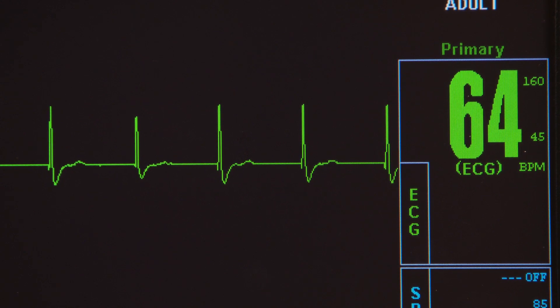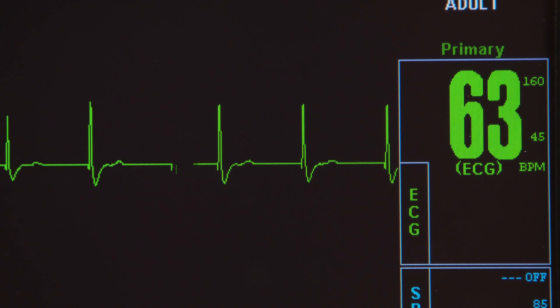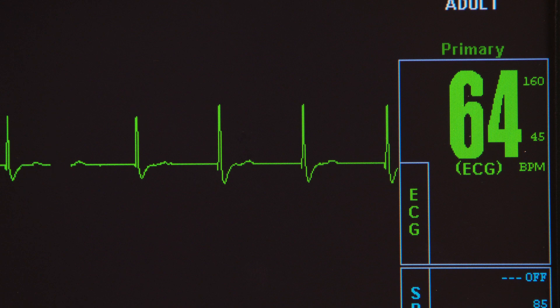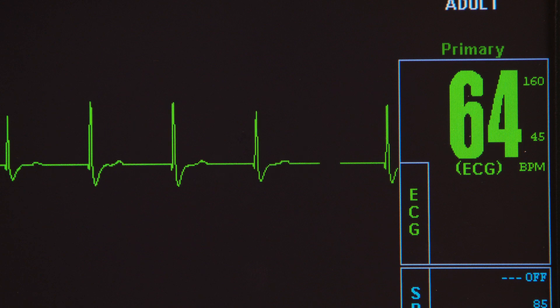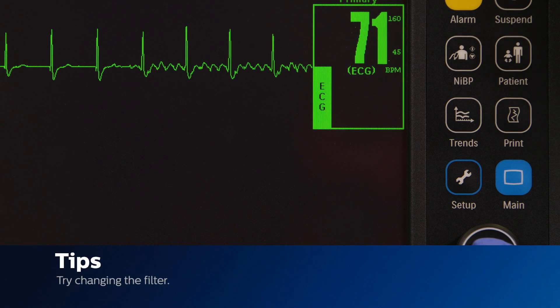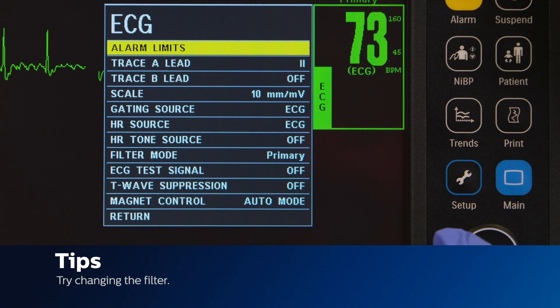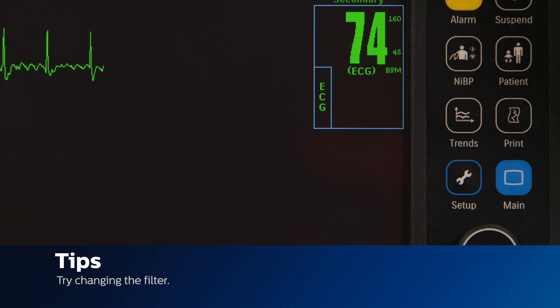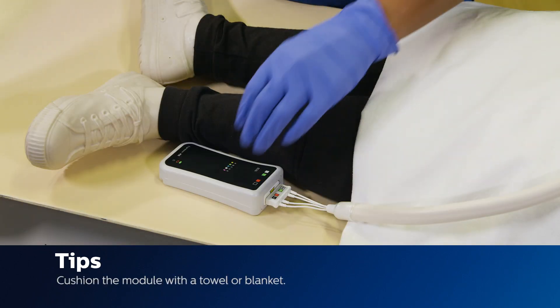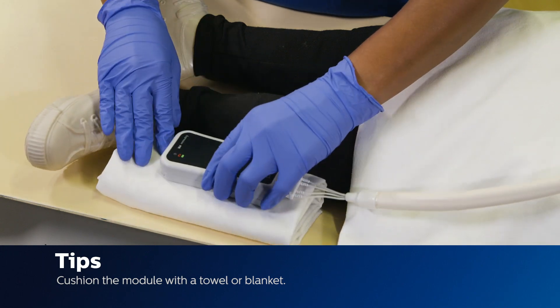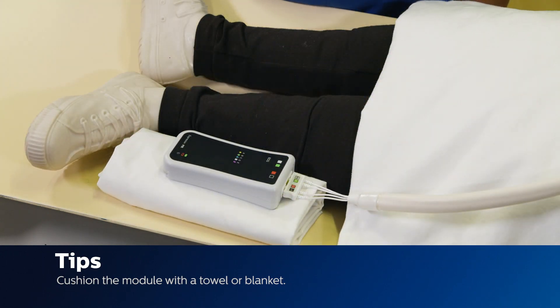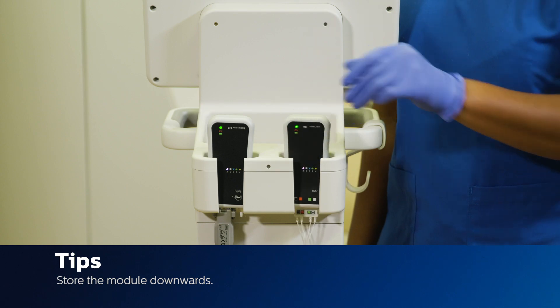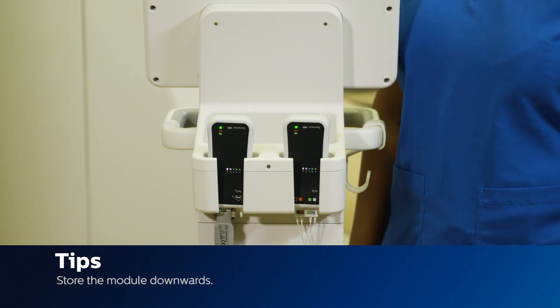If you prepped your patient correctly and placed the quatrodes but are still not getting a one millivolt ECG signal, there are a couple of things you can try. If you begin to get artifact during the scan, try changing the filter — these filters were made to decrease artifact caused by the MR scanner. Place the module on a cushioned surface, such as a blanket or towel, to minimize MR scanner vibrations. When storing the module after the case, make sure to store it downwards where the leads are hanging, as storing it upwards will stress the cables and eventually break them.